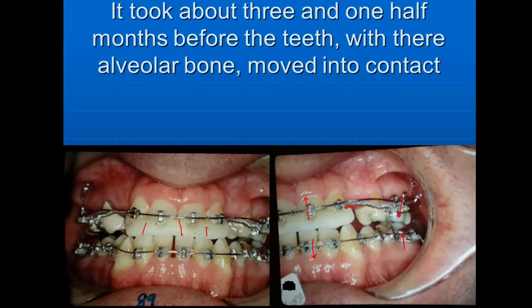I did some one time out of Concise. It took me half a day to reconstruct the teeth after grinding them out. So that person has a permanent sealant on the teeth. Concise just didn't come off at all.